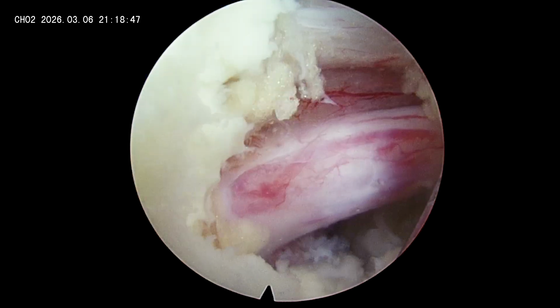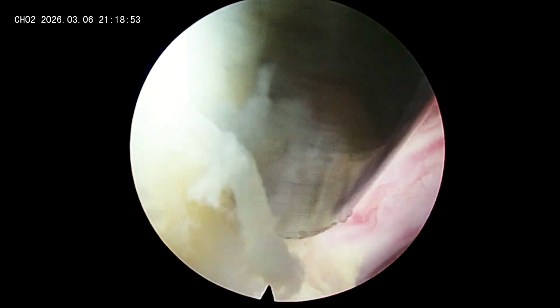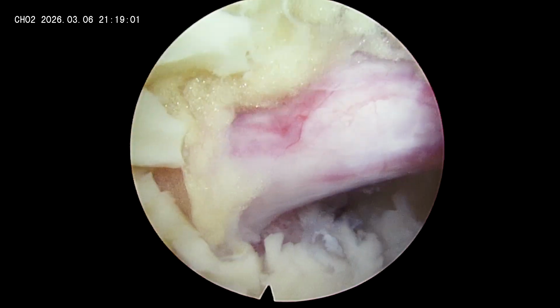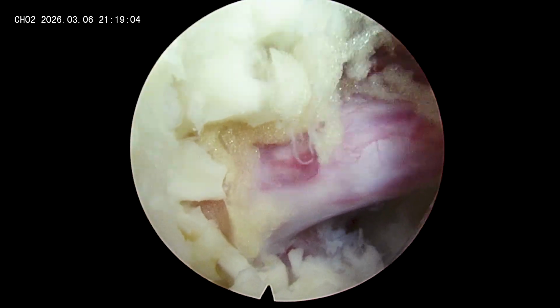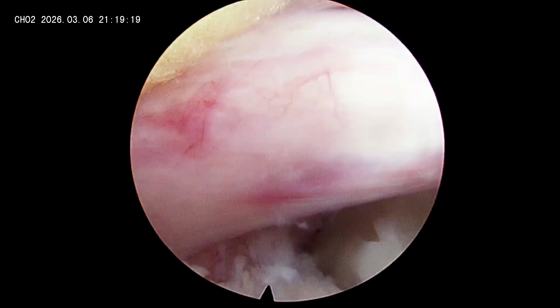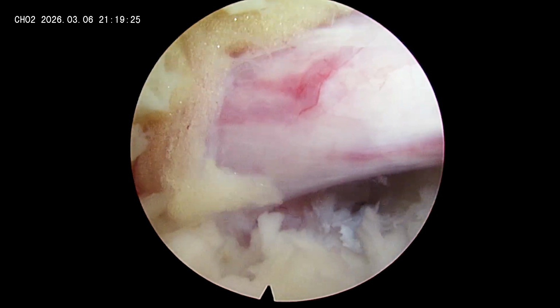This is not necessary actually, but whenever you see it, you get tempted to remove that part. So here I just want to detach the traversing nerve root from that vessel, and it will be free. It will take 5 to 10 minutes more. Ideally speaking, we have finished our surgery, nothing to do here, just because I saw some sort of less mobility, so I'm just doing it.